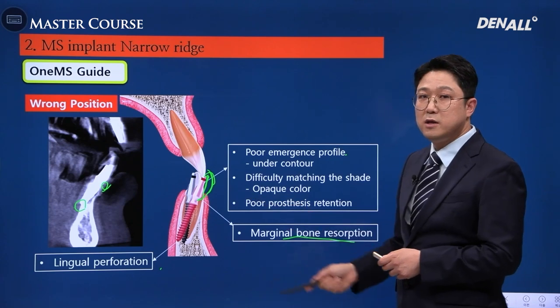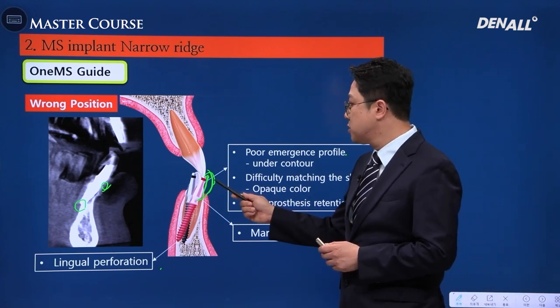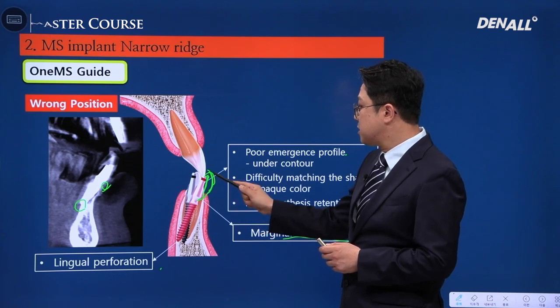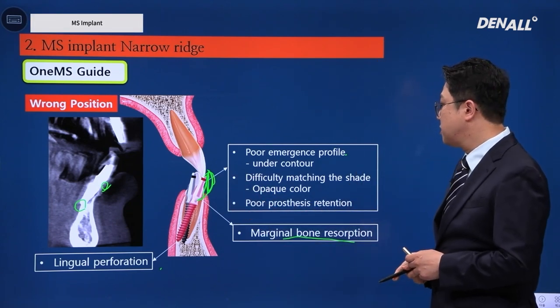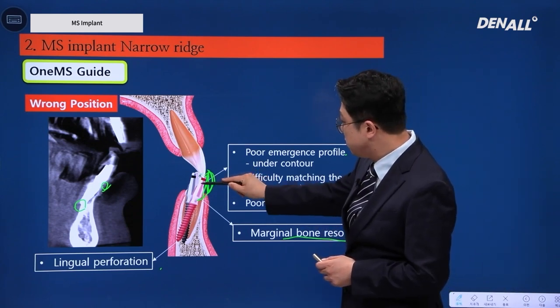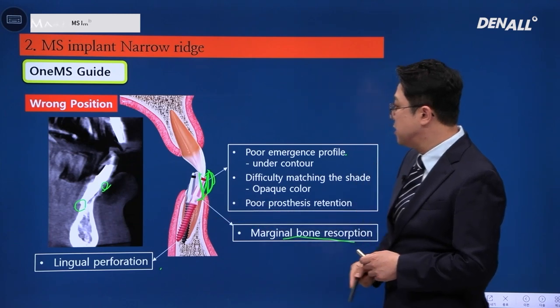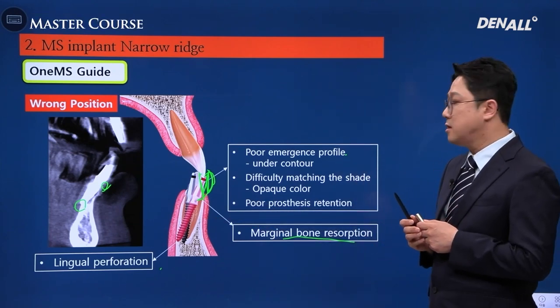If you fabricate a class 3 type of prosthesis, you need to make it thin. In the case of PFM, opacity can show through. If you prep the abutment because of these reasons, the length of the abutment will be reduced and it will lead to retention issues. It can be a bit of a pickle.